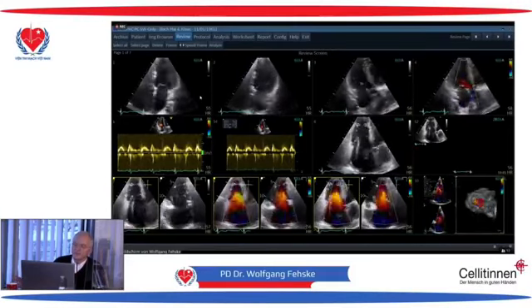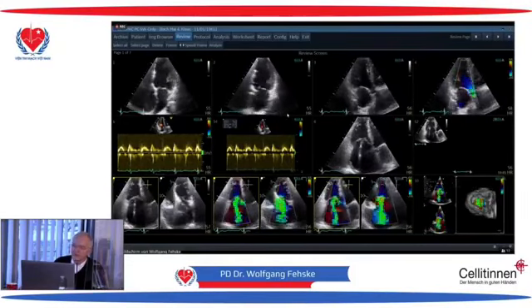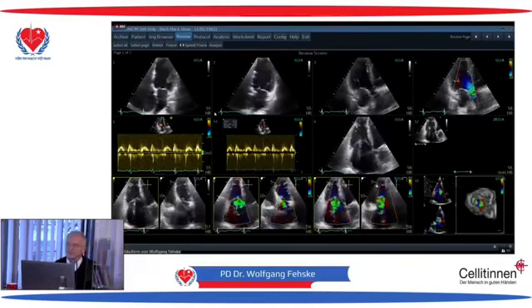So would you like to translate it? First of all, this is the standard approach, and then I will explain a little bit.